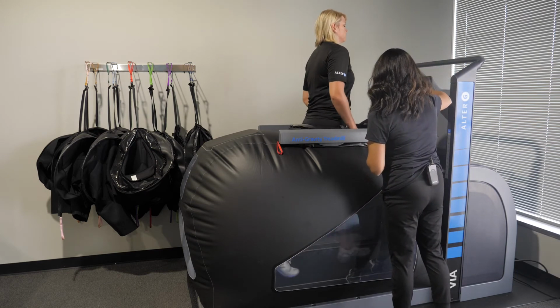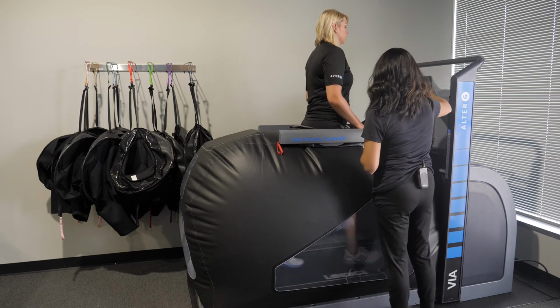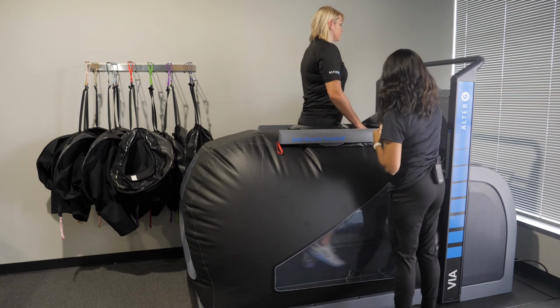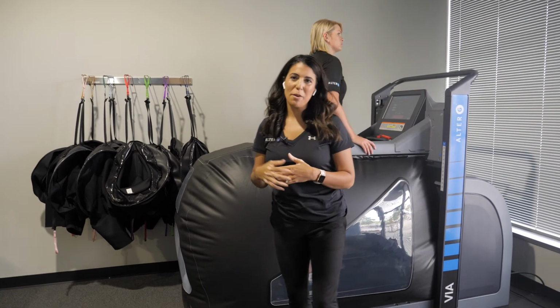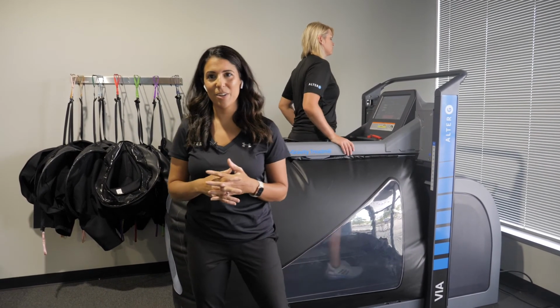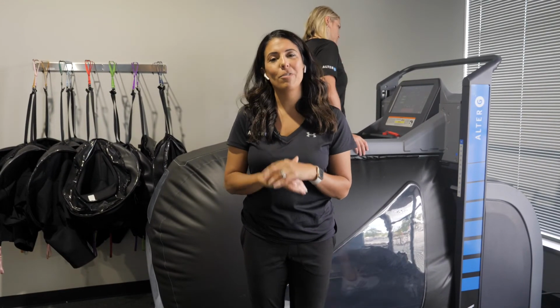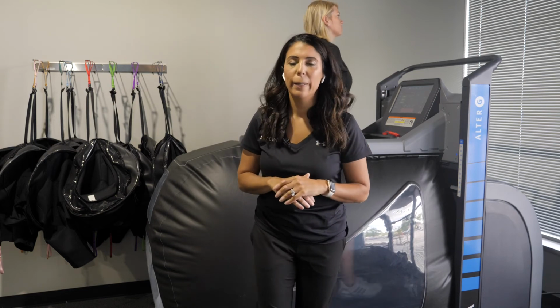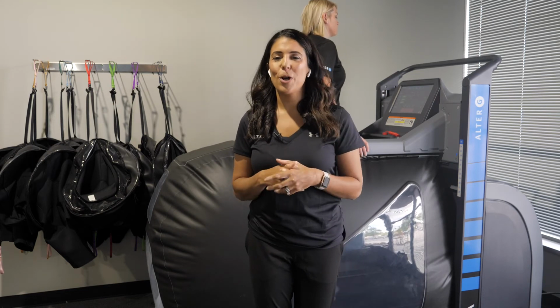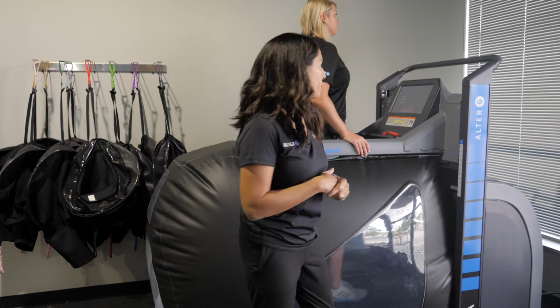All right, so we're going to re-weight her. So I know you can't see the software right now, but we will have videos that follow this one, with a direct screenshot of the StrideSmart software, so you can see all the different capabilities of the software. But just keep in mind what the features are and the benefits of having that gait analysis coupled with the body weight support.